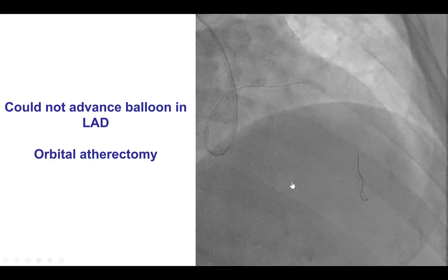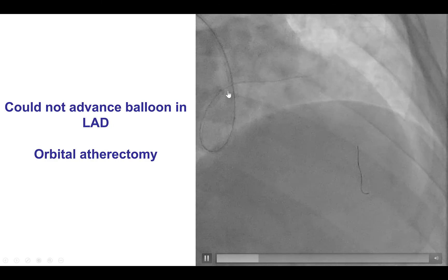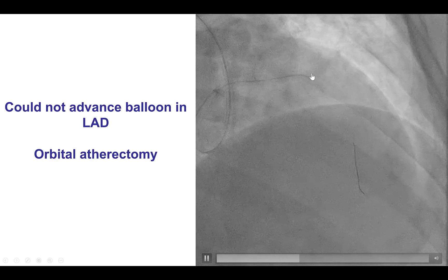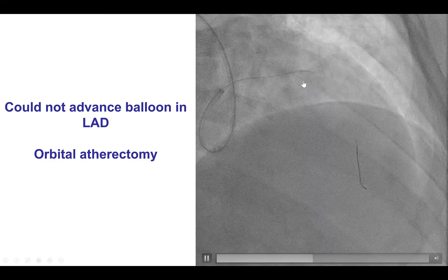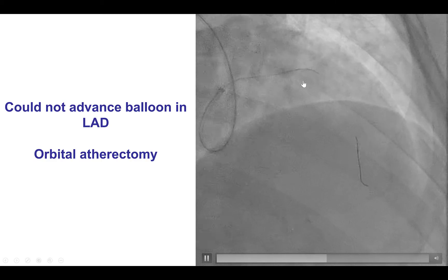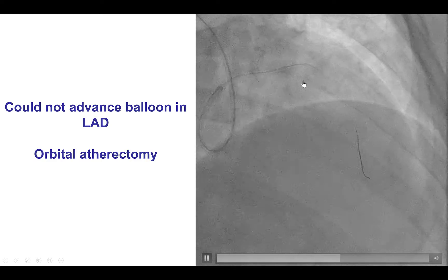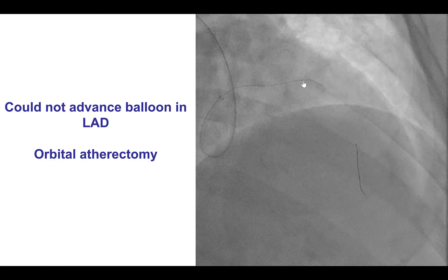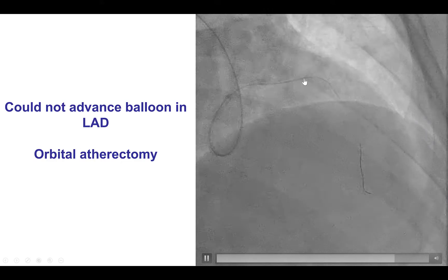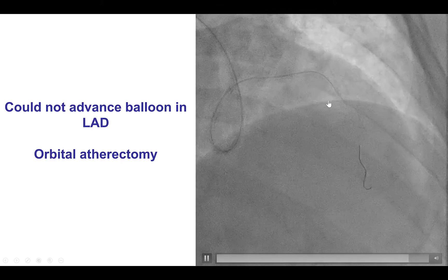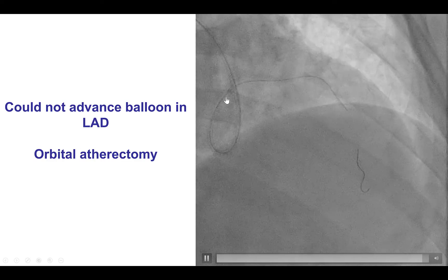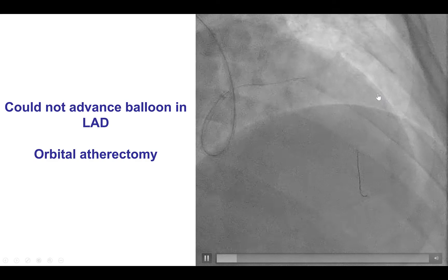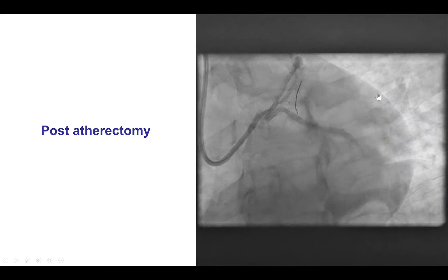The next question was how to treat the LAD. We tried to advance a balloon there but the balloon could not even cross, which was another indication for atherectomy. We exchanged our guide wire for a viper flex-deep guide wire and performed preparation of the LAD using orbital atherectomy.